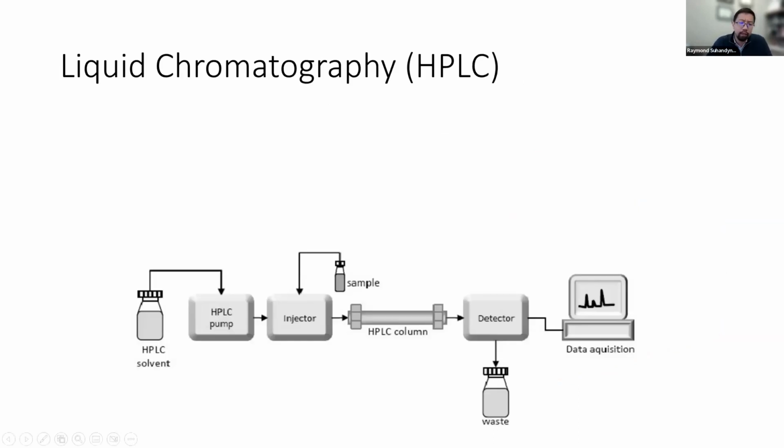Okay, so by far and large, one of the most commonly used chromatography systems is liquid chromatography for bioanalytical analysis. In the past, it was sometimes GCMS, or gas chromatography mass spectrometry, but most everyone has switched to LC just for the compatibility with the specimens.